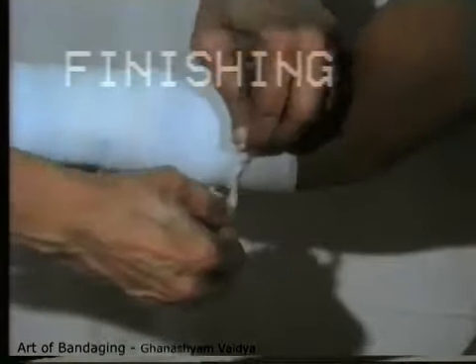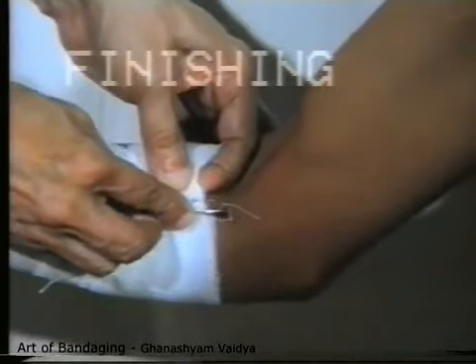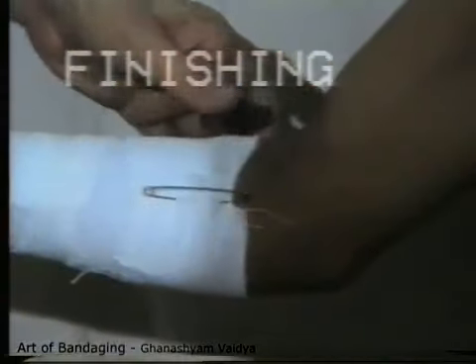Tailing the bandage. Split the terminal portion of the bandage longitudinally. Take one simple knot to fix the tails to each other and then tie the tails around the limb. If the dressing is wet or likely to be soaked with discharges, then the adhesive strips will not stick, so it is better to fix it by tailing. A safety pin may be applied to the end of the bandage along with the underlying turns. While applying the safety pin, the bandage should be lifted up to protect the skin.